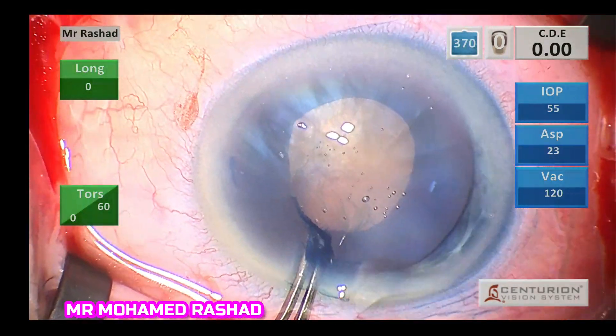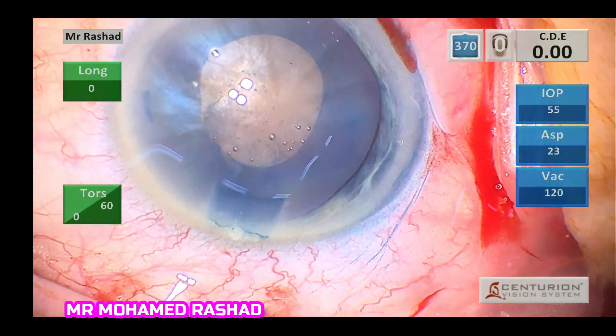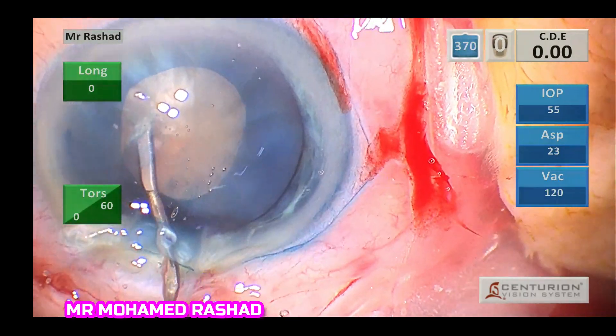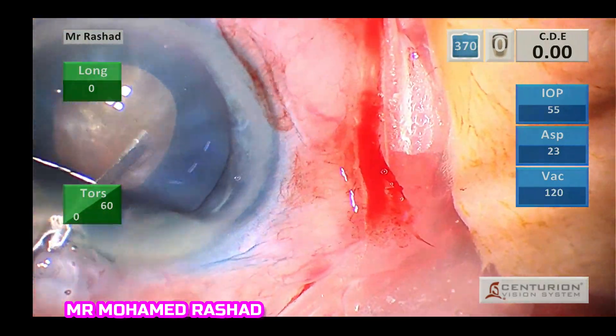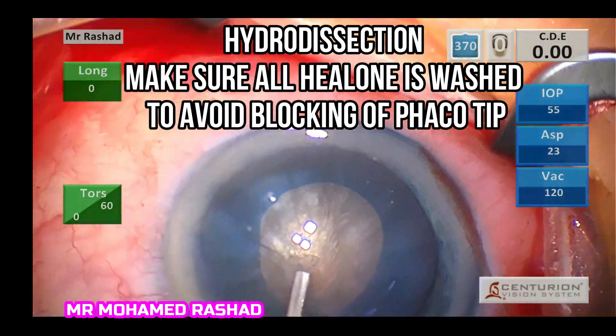After you finish your capsulorhexis — it is rounded but small — you can then enlarge it after implantation of the intraocular lens.